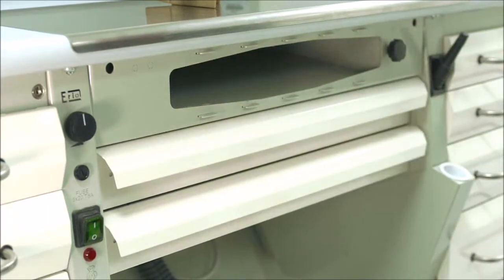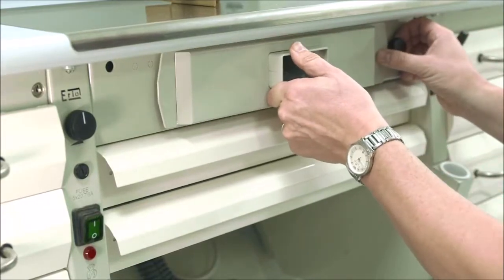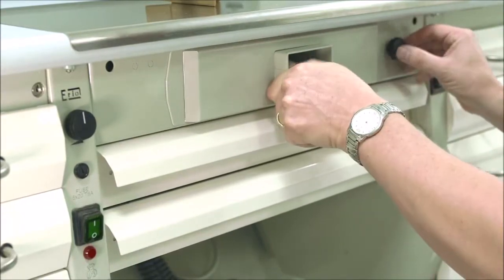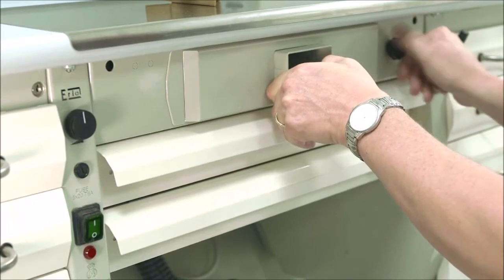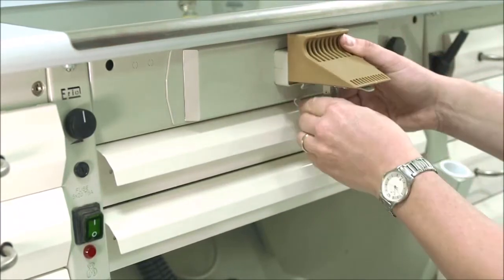Once you've replaced the filter, push back into the table, push to the right and tighten the black knob and replace the bench peg.